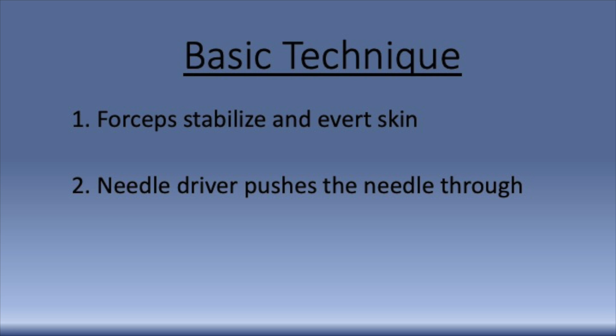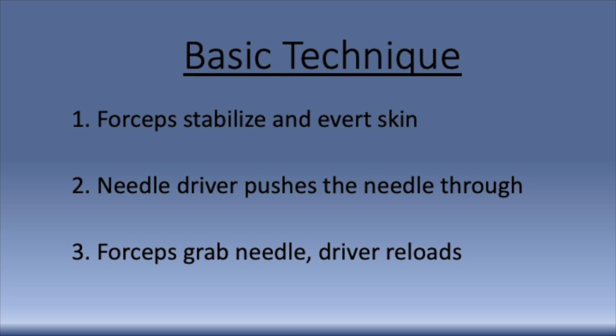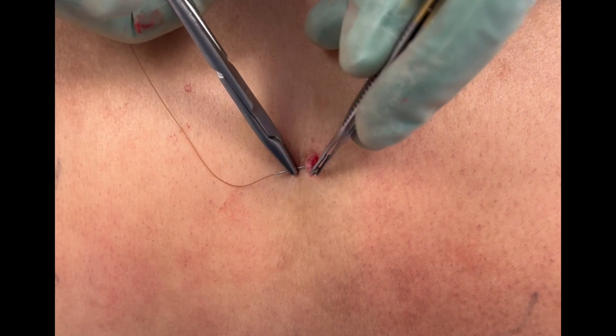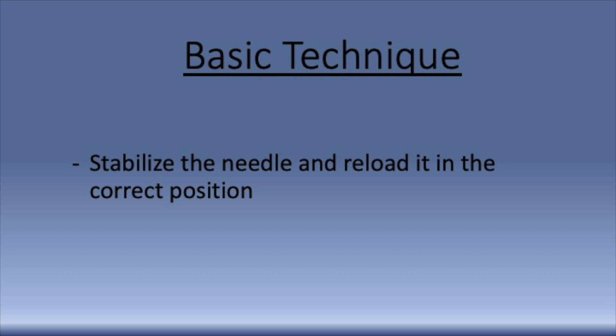Once the skin is in the proper position, the needle driver gently pushes the needle through, always following the curve of the needle. Next, the forceps are used to grab the needle, rotate it through the skin, and stabilize it on the skin so that the needle driver can reload it. It's much easier to reload the needle into the needle driver while stabilizing it on the skin of the patient rather than trying to do it in the air.